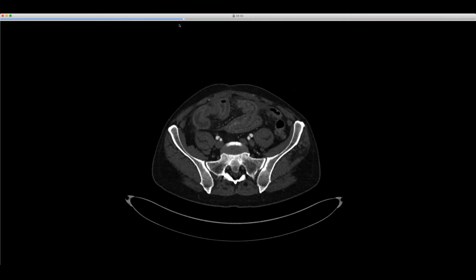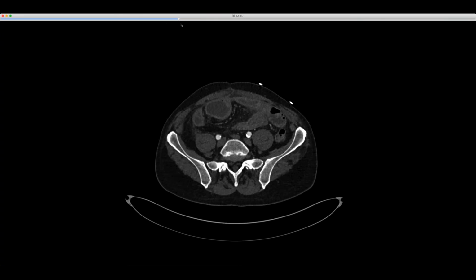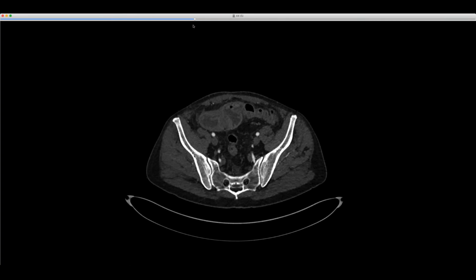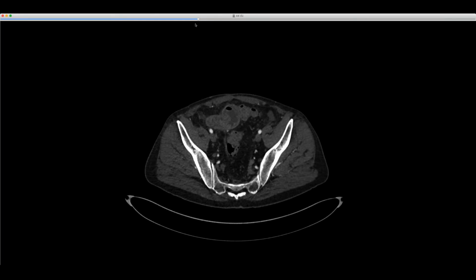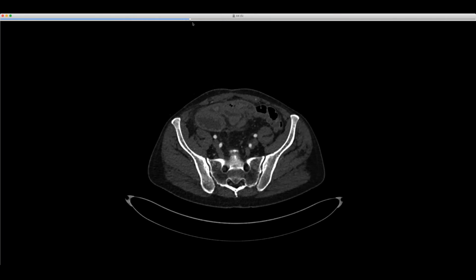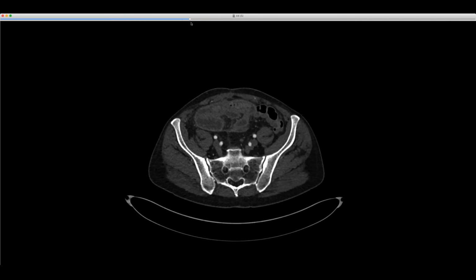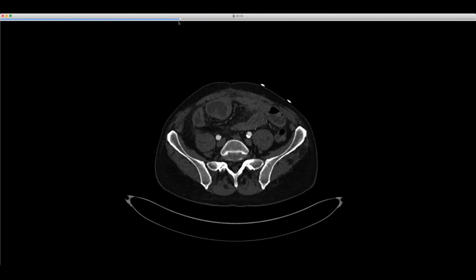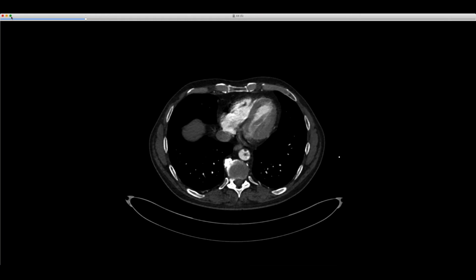And you can see that the bowel doesn't look good. So we checked out the SMA, and there was no thrombus. I should tell you this patient has Crohn's disease, so presumably this was due to Crohn's disease. It may also have been due to some emboli that got thrown and then dissolved, but we didn't see any large emboli in the SMA. I just thought that was a good case of a free-floating thrombus.